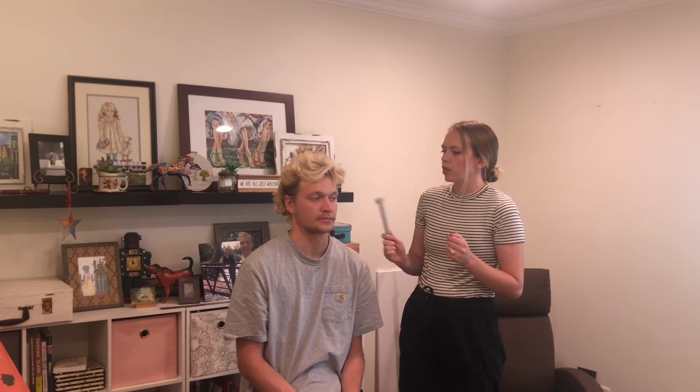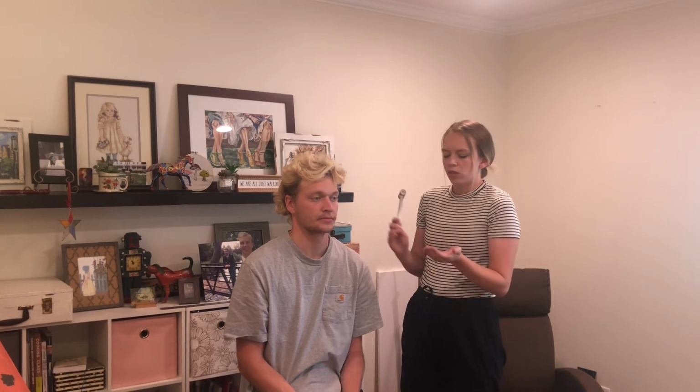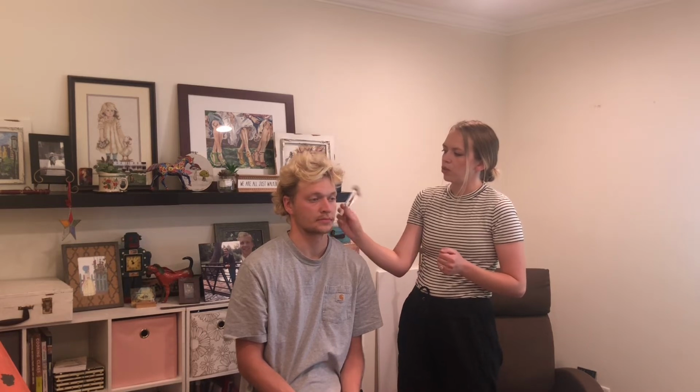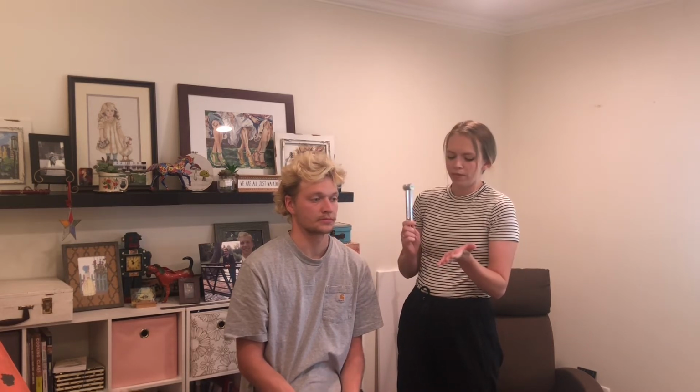This will check for bone conduction as well as air conduction. So tell me when you stop hearing it. I'll put it against your mastoid, and then tell me when you stop hearing it, and then when you do, I'll move it to the outside and tell me when you stop hearing it.